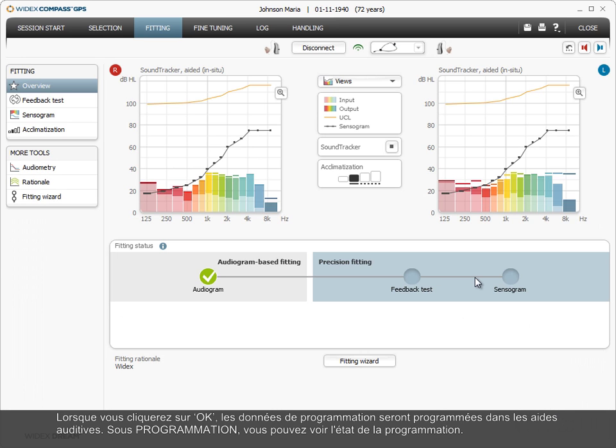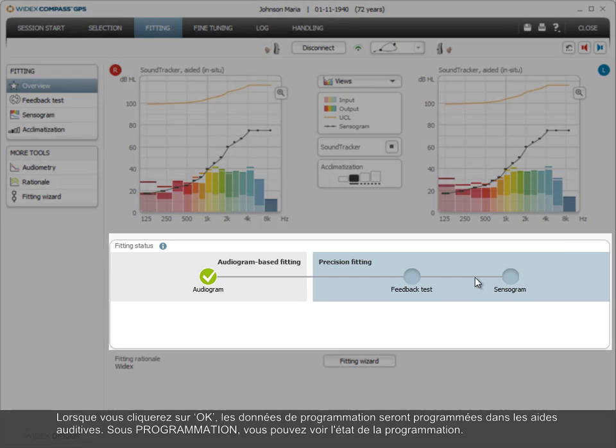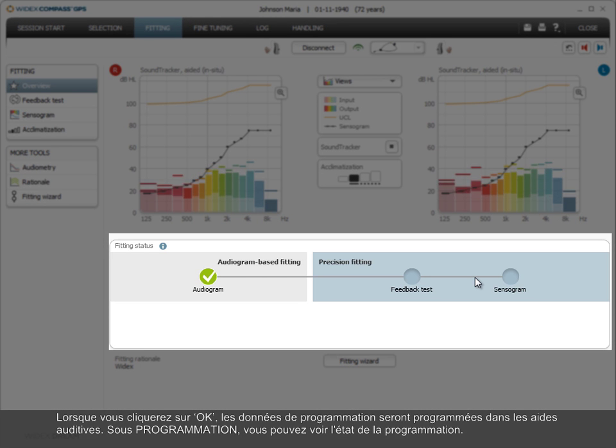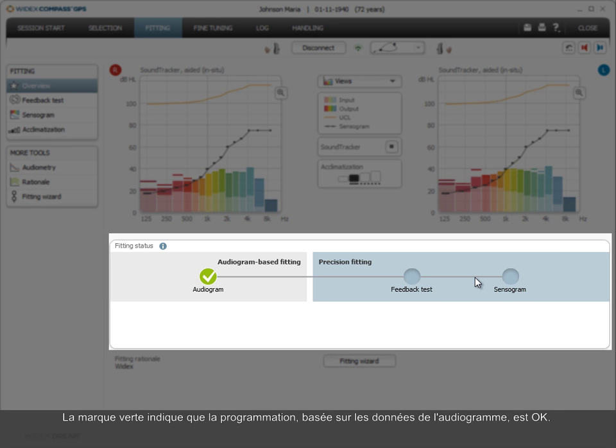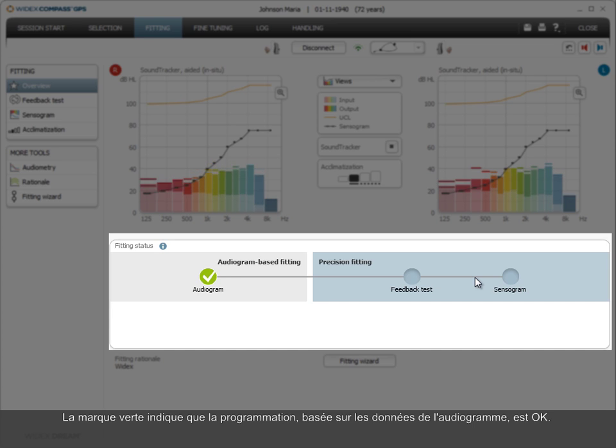Here in the fitting overview, you can see the fitting status. The green check mark indicates that the fitting, based on the audiogram data, is OK.